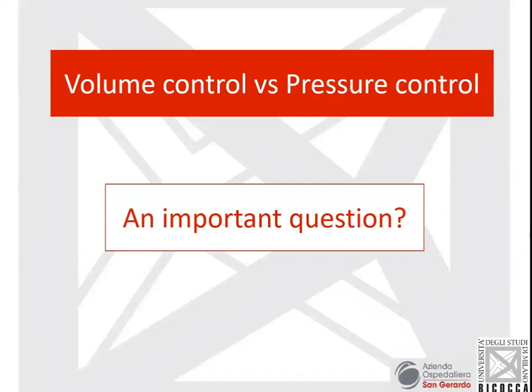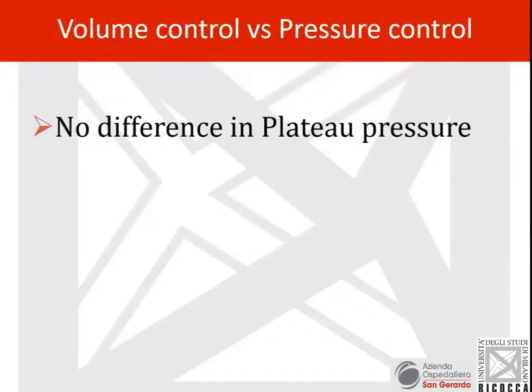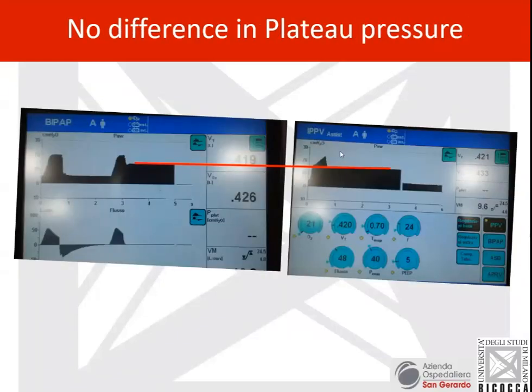Certainly, the principle on which these ventilatory modes work is very different, but it is important to recall that, first of all, there is no difference in the pressure that the patient will receive, whether we are on pressure control mode or volume control mode.